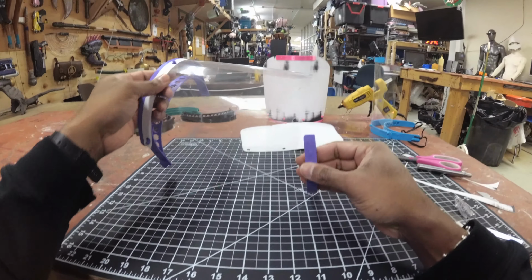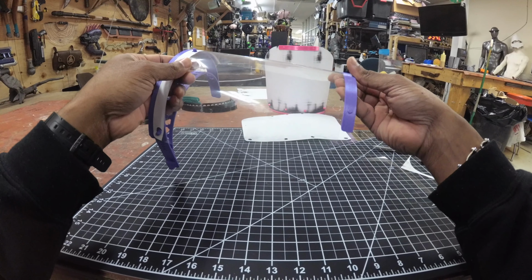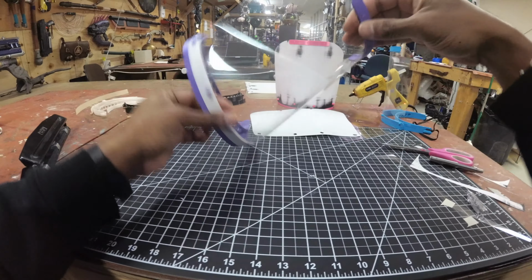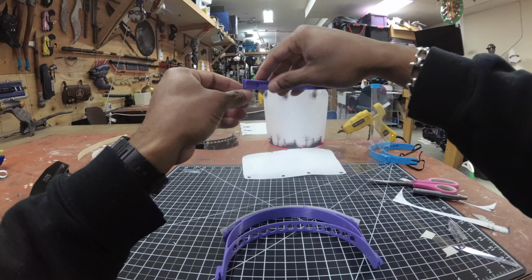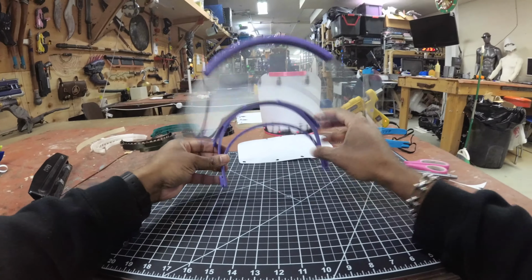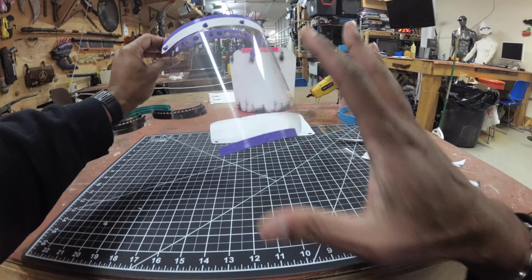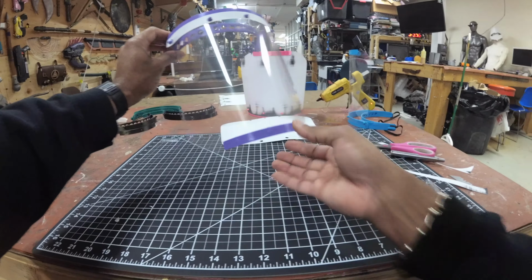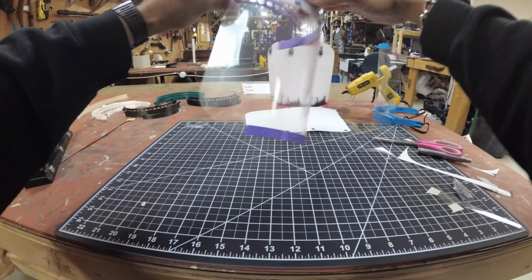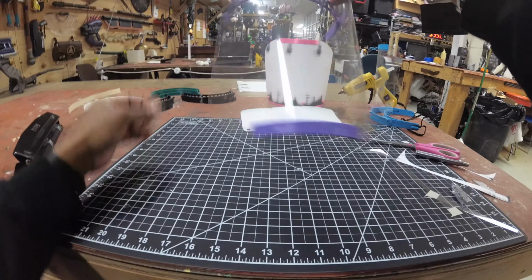Again, same thing as before. You go ahead and just kind of slide this towards the edge, and then push down so that we get our pieces in place. Okay. And this piece does actually serve a purpose because it does prevent the mask from blowing backwards on someone. So it keeps it taut there in the center, so it gives it a lot of rigidity towards the front there. So as you can see, just shaking it back and forth, it's not going anywhere.